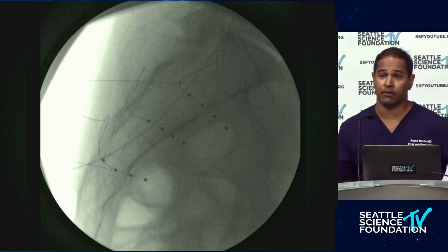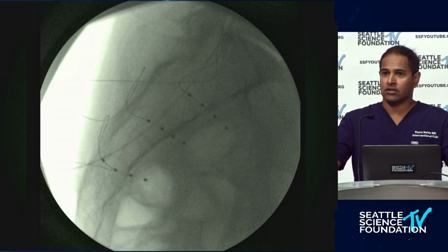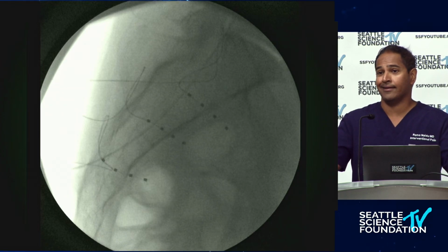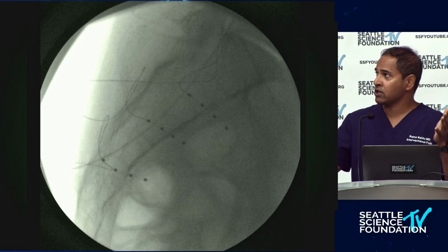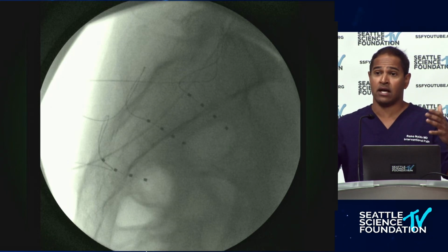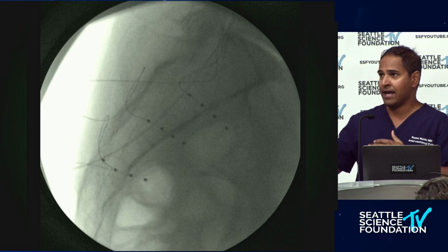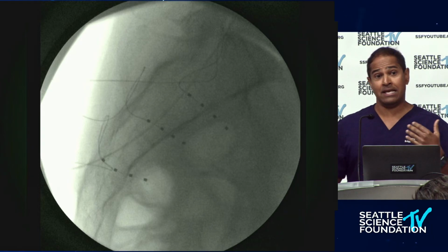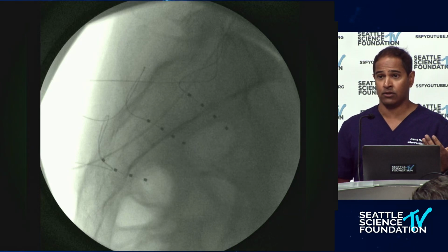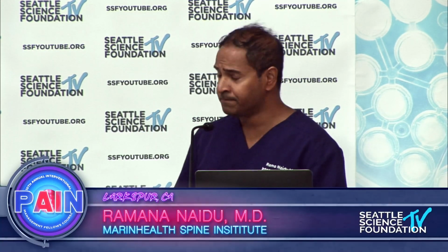For peripheral neuropathies, as you know, they generally ascend, right? So I always start with S1. And one of my criticisms of how Abbott has taught us to do this procedure is that we always focused on T10 through L5, and S1 was sort of an afterthought, or S2 was an afterthought. S1 is one of the easiest DRG placements you can possibly do. It takes 10 minutes to do bilateral S1 lead placement. As long as you become accustomed to it, it's really straightforward.